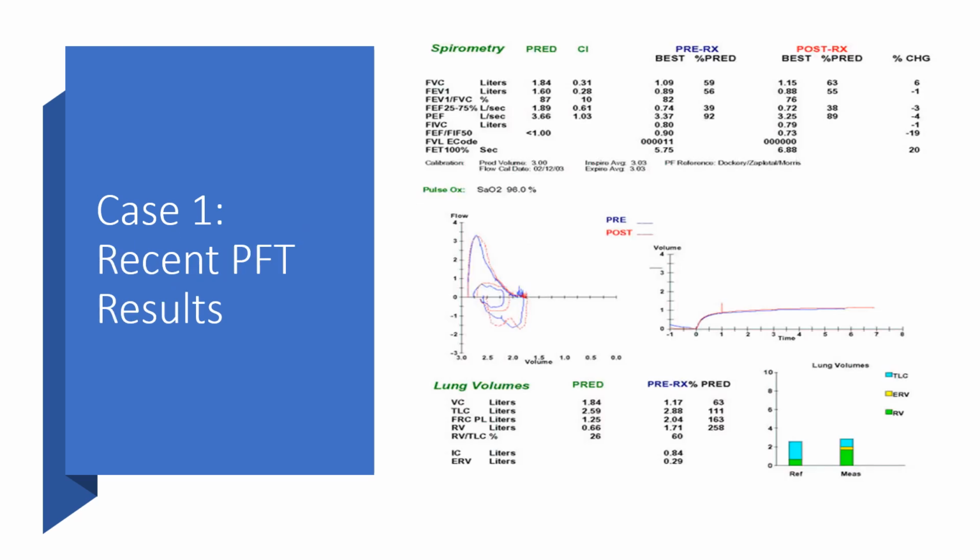So there's a lot of information on this slide. This is the actual printout of this patient's pulmonary function testing. Just to look at it at a glance, it could be overwhelming. In the interest of time, I really want to focus on the information that's in the upper right, and then the information after that in the lower left.